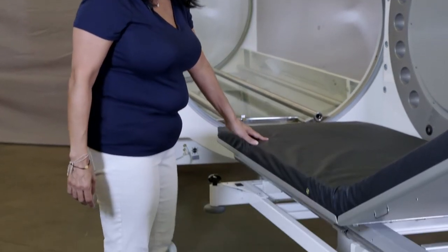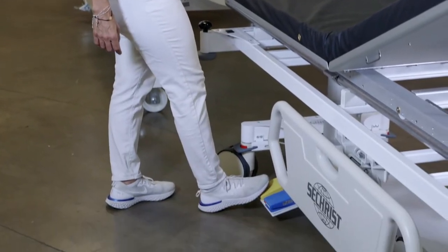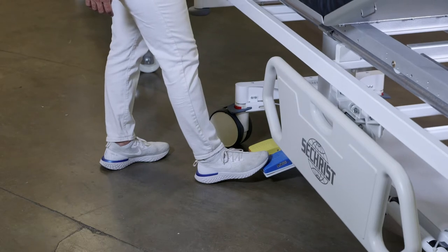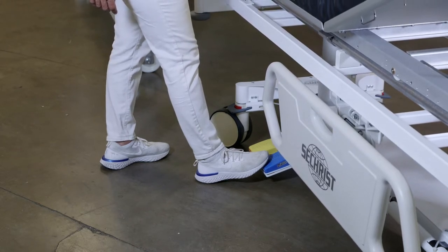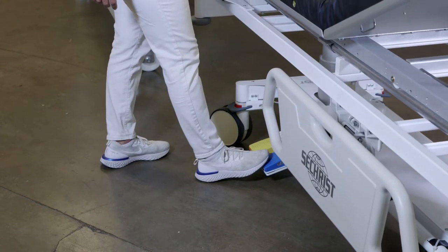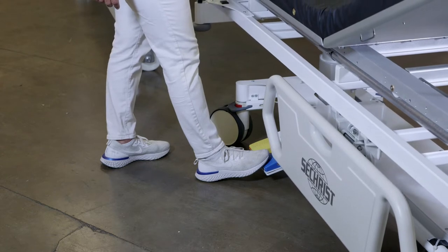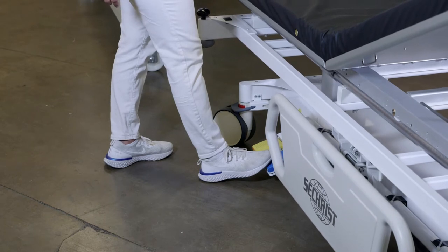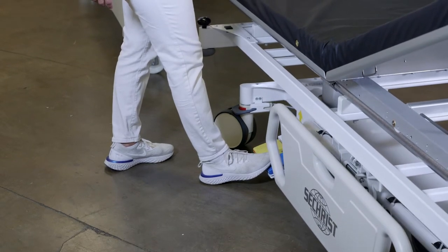One of the first features we want to focus on is our electronic up and down — there's no more need for you to pump on a hydraulic gurney. You'll notice here we have two buttons: the yellow with the yellow arrow for up, and the blue with the blue arrow for down. The Sechrist wheeled gurney has a unique feature in that when it goes all the way down, it is about 17 inches lower than most other standard hyperbaric gurneys in the market.